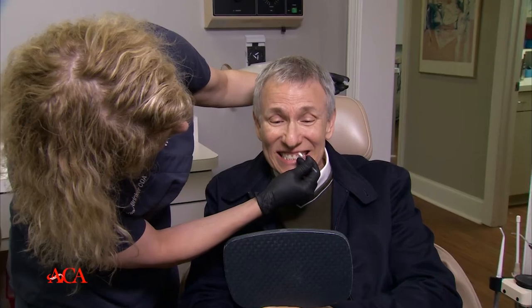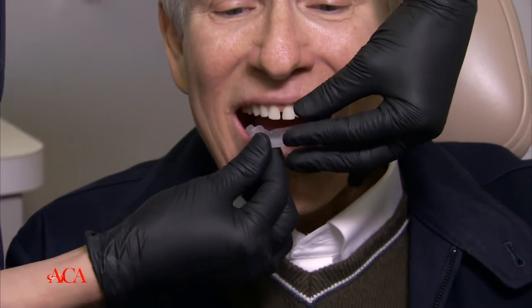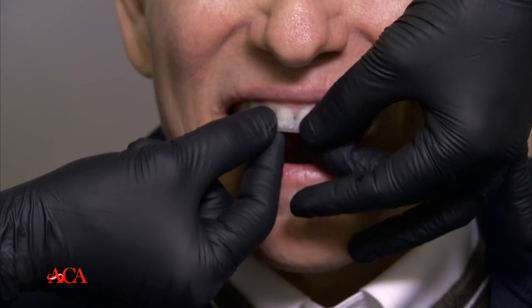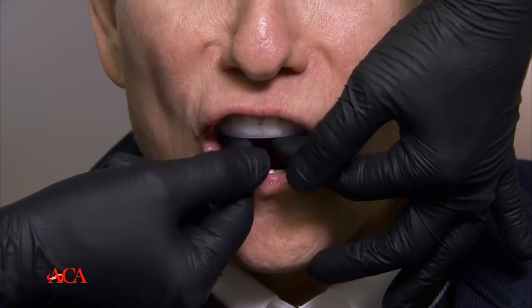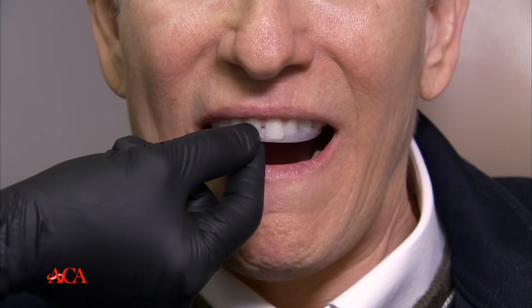First, put a little bit of oil on your gums, because when you seat the tray, if you pinch it too much the whitening will touch the gums. The oil acts as a barrier. I'll also put a little bit on your palate just to be safe — I'll give you a few of these to keep that area protected. Now I'm going to take the tray and seat it — just place it right in like that, and push just a hair. Even Vaseline or chapstick works as a barrier. Then bring your lips over the top just a little bit, and the tray goes all the way back to about the first or second molar.